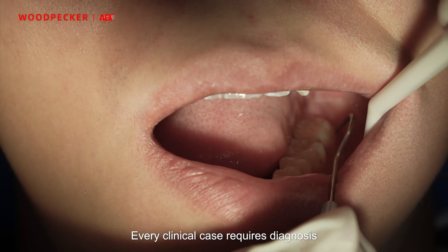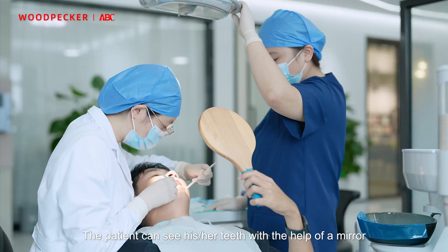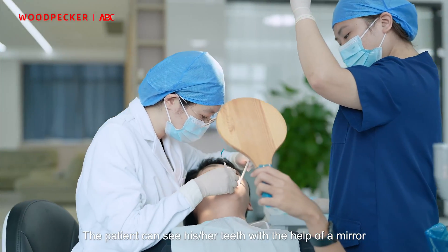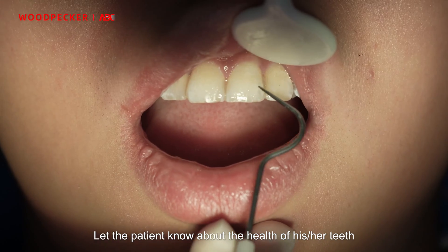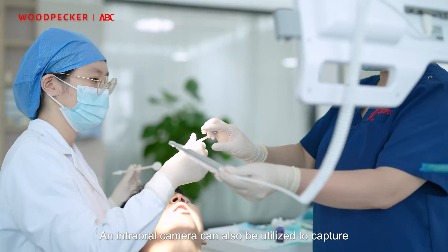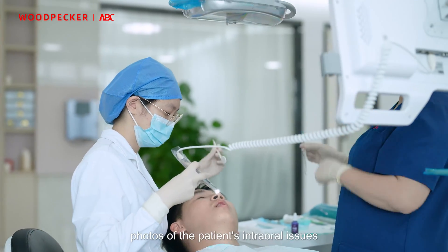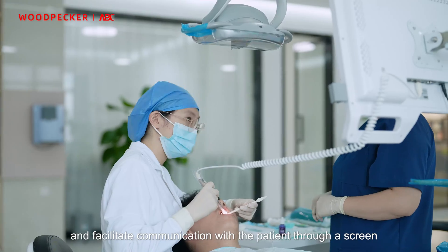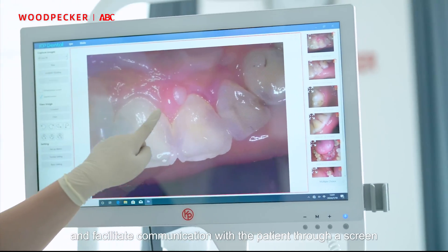Every clinical case requires diagnosis. The patient can see his or her teeth with the help of a mirror. Let the patient know about the health of his or her teeth. An intraoral camera can also be utilized to capture photos of the patient's intraoral issues and facilitate communication with the patient through a screen.